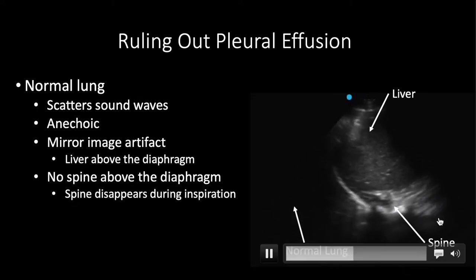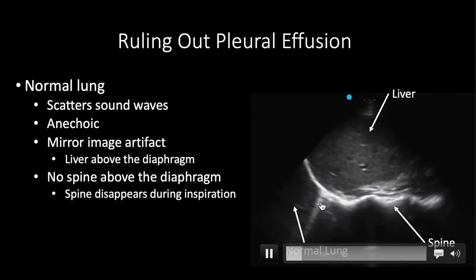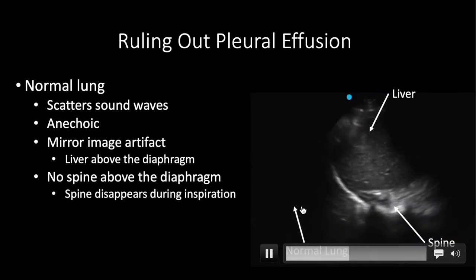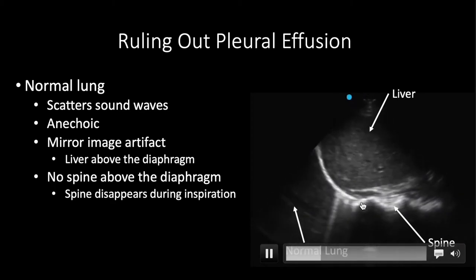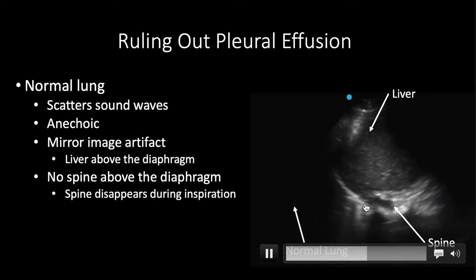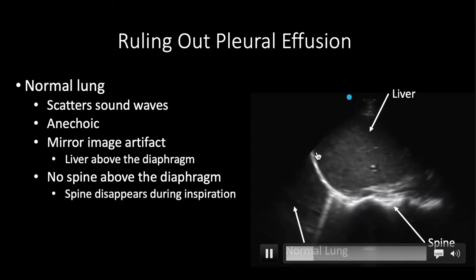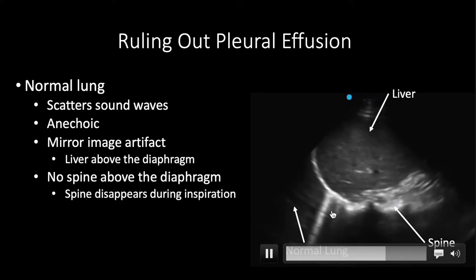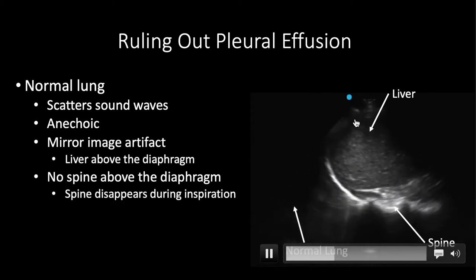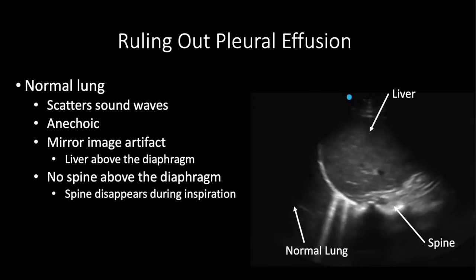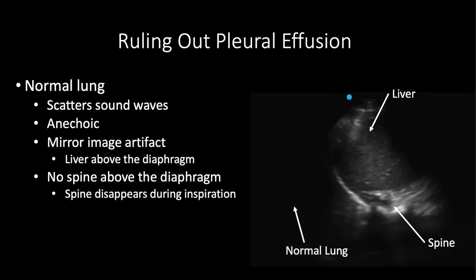The key is identifying the spine and realizing it never continues above the diaphragm. As the patient breathes in, the diaphragm comes down and the spine disappears. The ultrasound waves entering the lung don't hit the spine and bounce back because of air scattering. So even though there truly is spine above the diaphragm, normal lung makes the spine disappear above it.